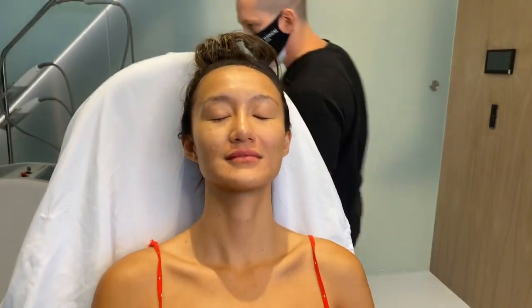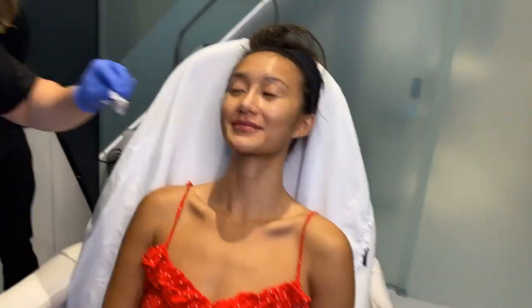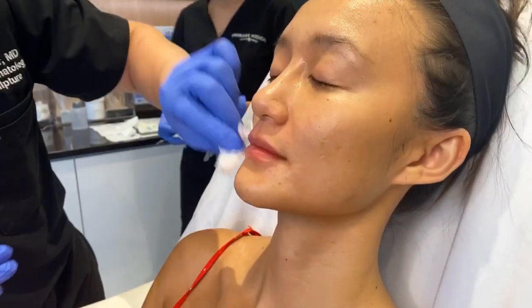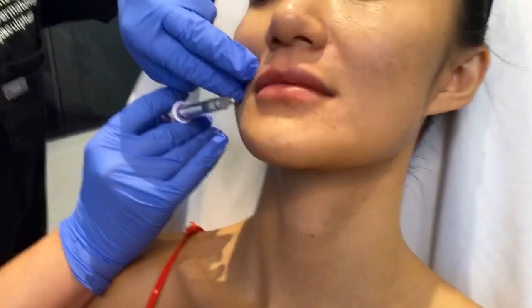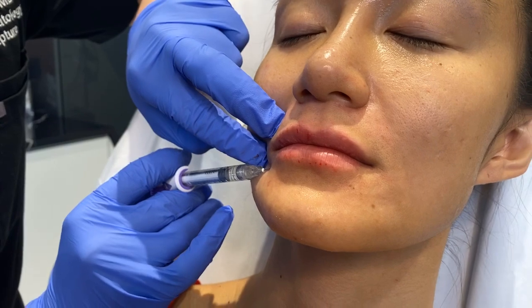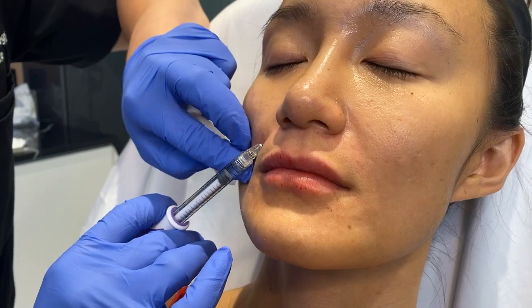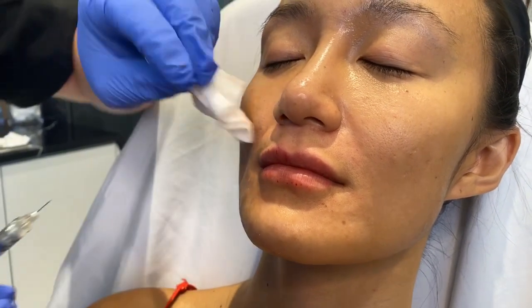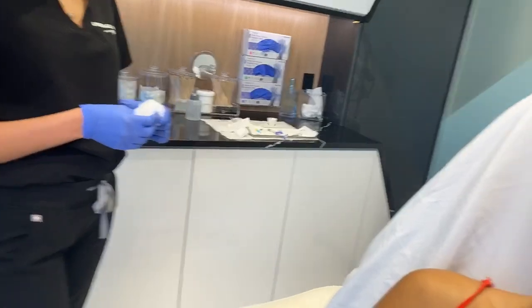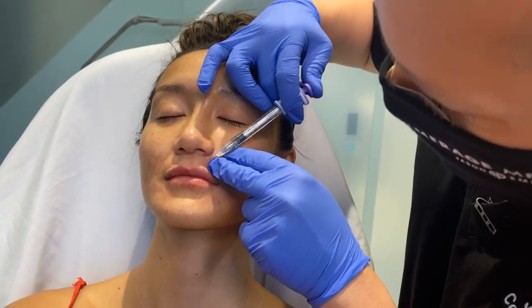So take a look in a second. I'm just going to grab a little alcohol. I'll go to the opposite side. Cool, it's white, looks really good. I just want everyone to see that when it's a little shiny, you can usually tell. So again, we're just going to do a little support right at the corner, very little. Nothing crazy because she's younger. When you get a little older, you might need a little more here. And again, one little pinch on the fold. And then I want to go to the other side for a second because, sorry, I keep moving. This area here, I want to get a little more elevation.